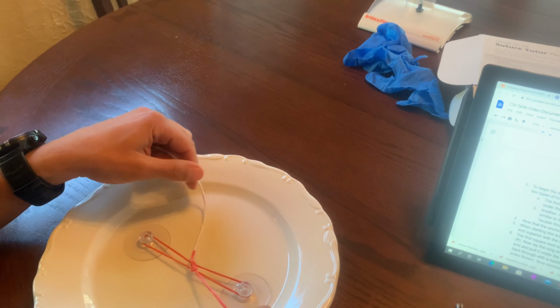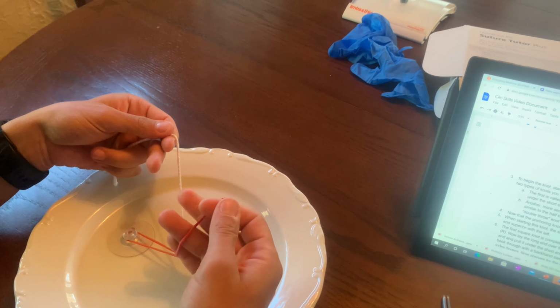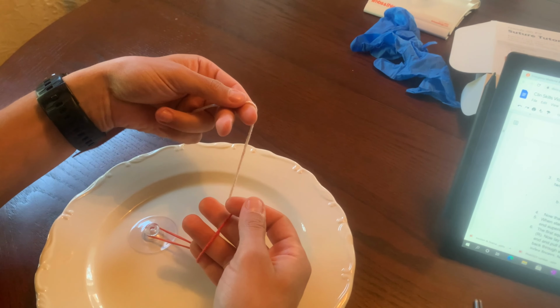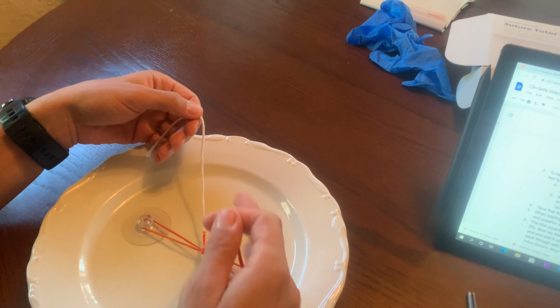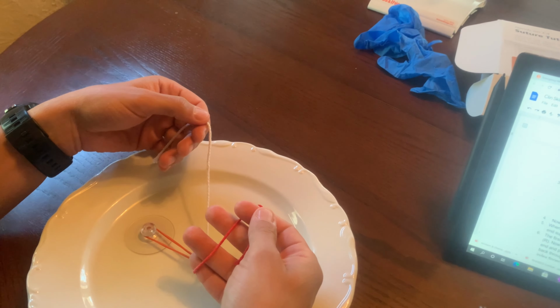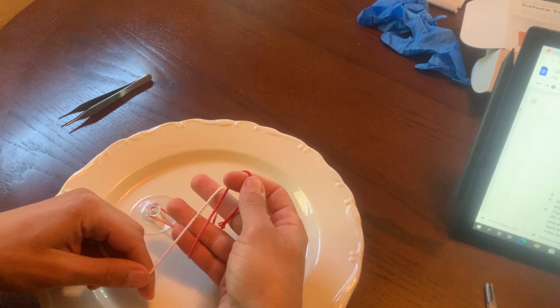So when starting with this knot, the short end should be held inferiorly with the right hand, and the long end superiorly with the left. So the first square knot is completed by draping the short end over the third, fourth, and fifth digits in the right hand. Now lay the long end over the same digits.